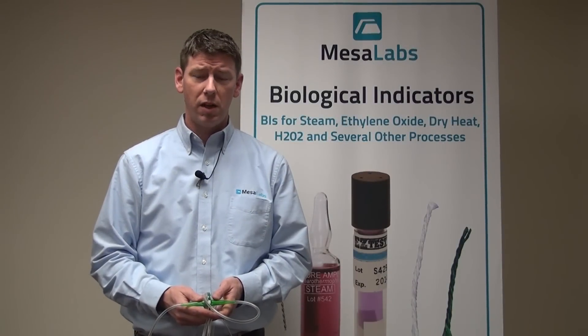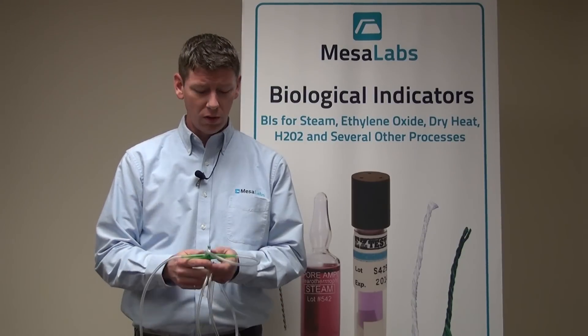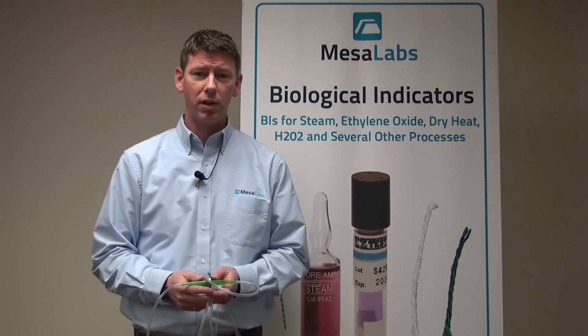Hi, I'm Dan Dwyer with Mesa Labs and today we're going to talk about validating the sterilization of tubing using the ProLine PCD Biological Indicator.